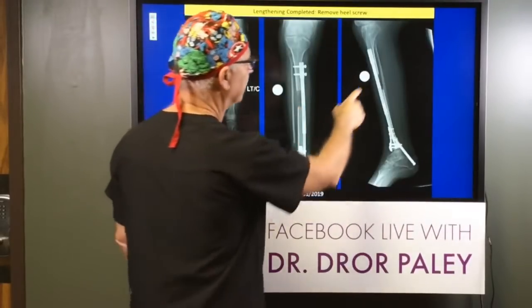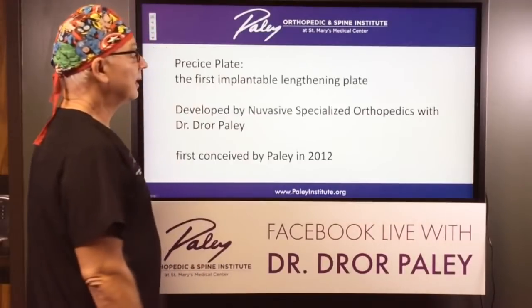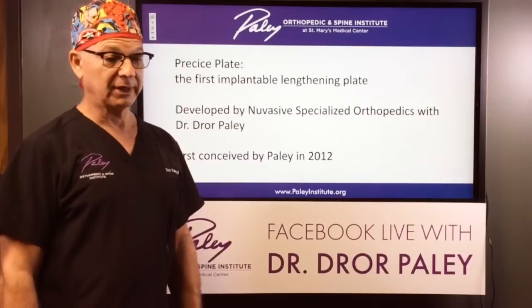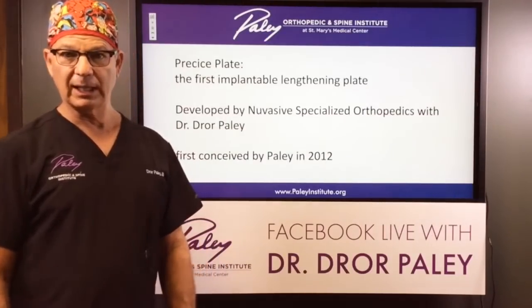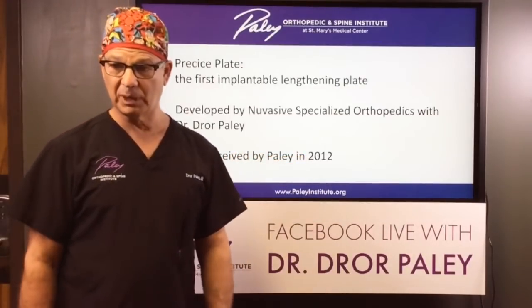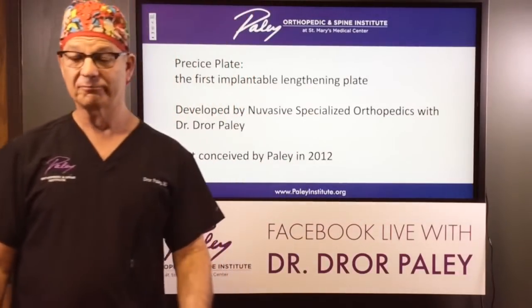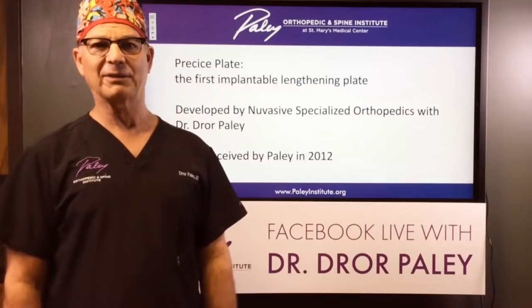And the first lengthening plate was implanted by us on September 10th, 2020. And on that day, we put 2 on the tibia, 1 in the fibula, and 1 in the femur, for fibular hemimelia, tibial hemimelia, and congenital femoral deficiency, all congenital problems. And this thing's 145 millimeters, just under 6 inches, so it gives you an idea of how big that is. That's the tibial plate. That's a femoral plate, which is 165 millimeters, a little bit bigger. And there's Dr. Shannon here with me, and this is on the day we implanted our first one.